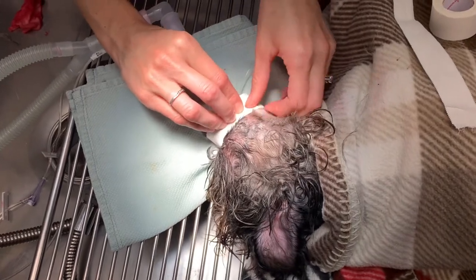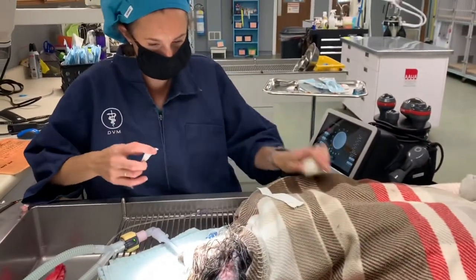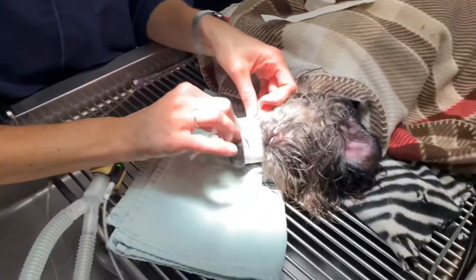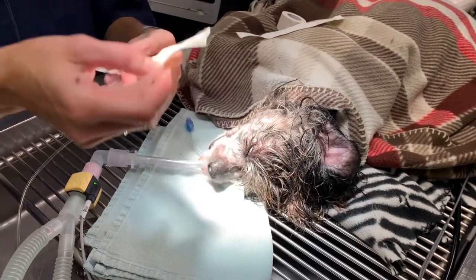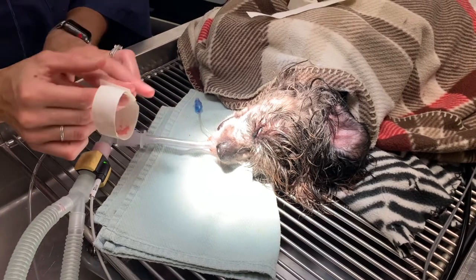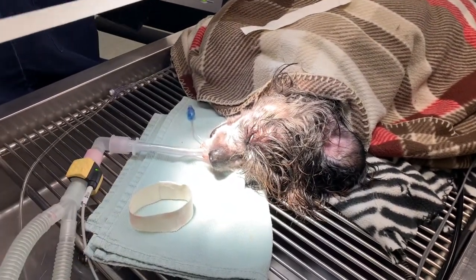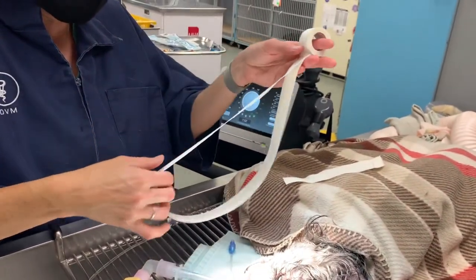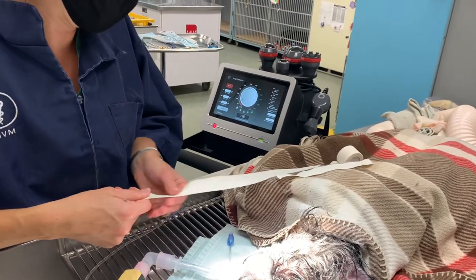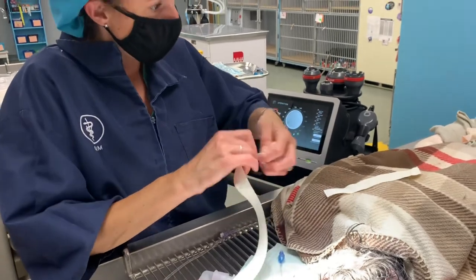Thankfully, this dog's got enough of a face to do this. Tape muzzles are nice because they're pretty cheap and we can make new ones easily — it's custom couture for the dog. We make a piece that goes across and then one that goes all the way around. I always fold my tape over on itself so it's strong but we don't need the sticky part. This dog will wear this for probably four to eight weeks. There's already somewhat of a fibrous union here — it's not completely unstable.